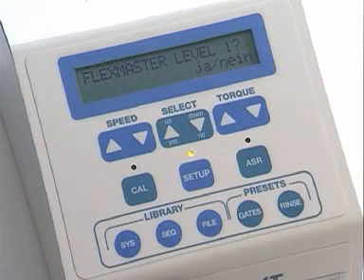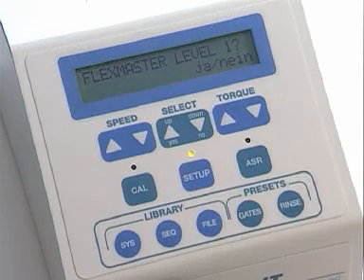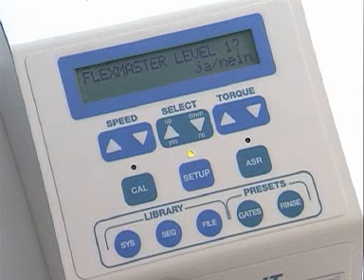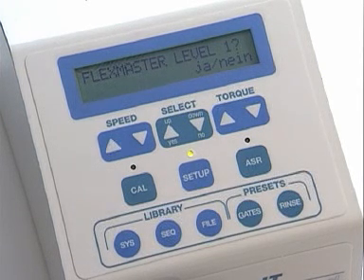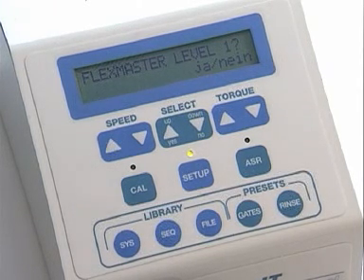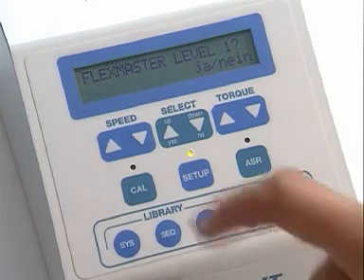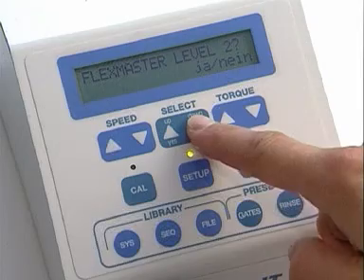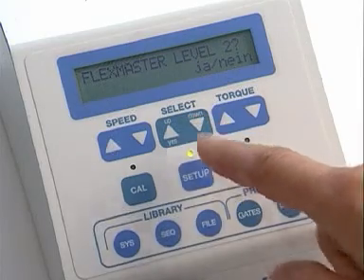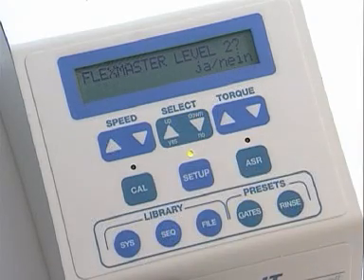The Flexmaster system has two operating levels: Level 1 with low torque settings for new nickel-titanium users, and Level 2 with higher torque settings for experienced users.